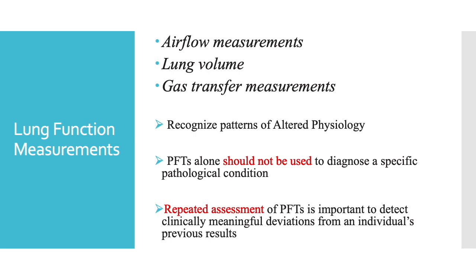But basically, whichever measure you want, we are trying to ascertain the patterns of altered physiology, and repeatedly the guidelines mention that PFT alone should not be used to diagnose a condition. It's very important to repeatedly assess and see the trend, as in the trend graph, to assess meaningful deviations in a patient's individual results.